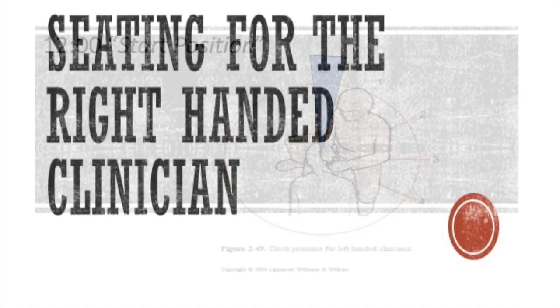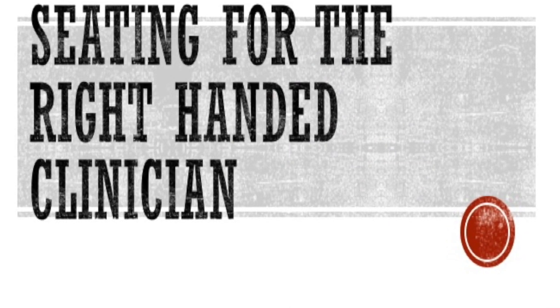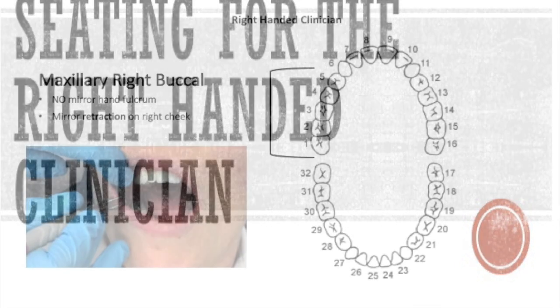Follow along in the instrumentation manual. Most of the positions will be used for all instrumentation. Let's begin with the right-handed clinician.